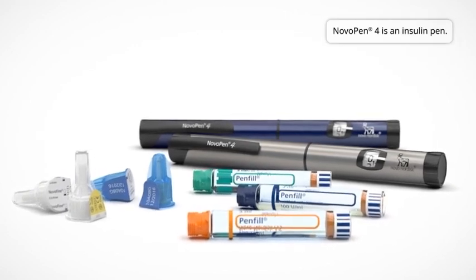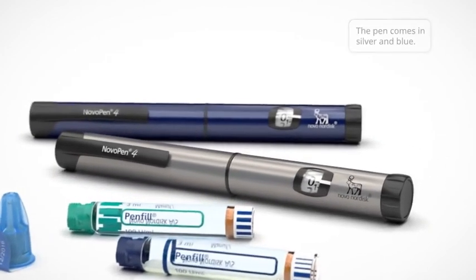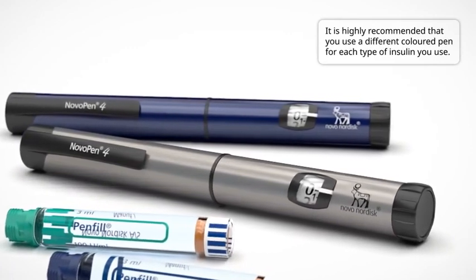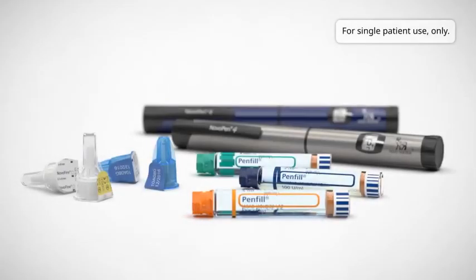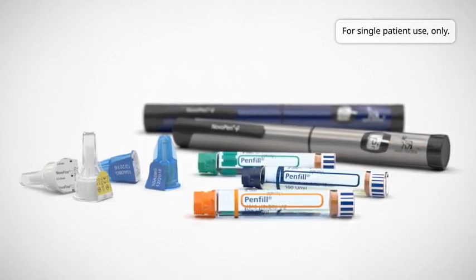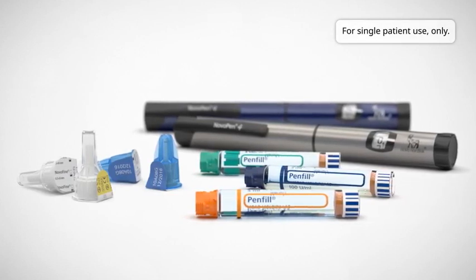NovoPen 4 is an insulin pen. The pen is available in silver and blue. If you use two types of insulin, it is highly recommended that you use a different coloured pen for each type of insulin. Do not share your NovoPen 4 or pen fill cartridges with other patients. Sharing the pen can result in the spread of infections from one patient to another, even if the needle is changed.